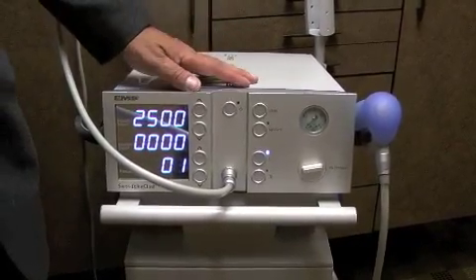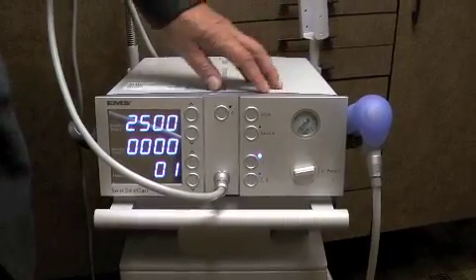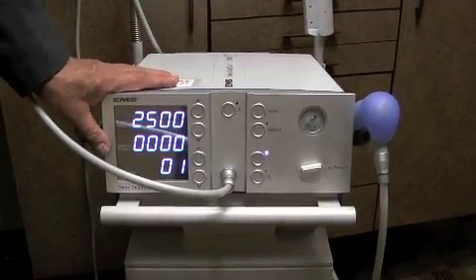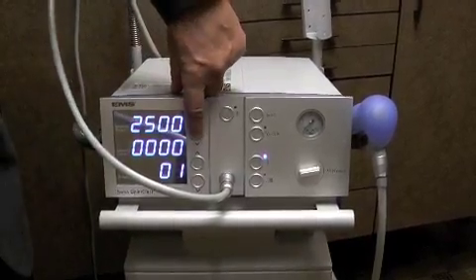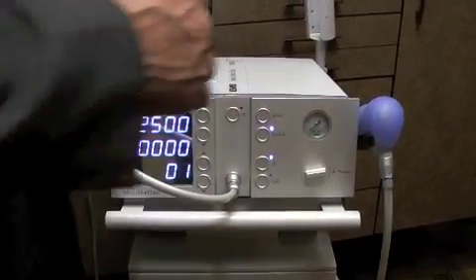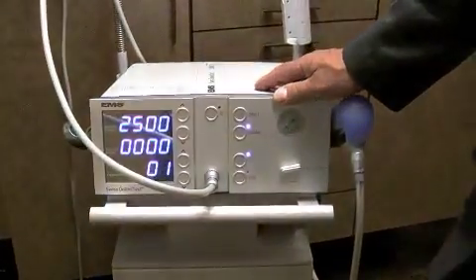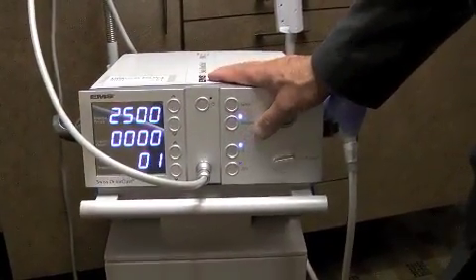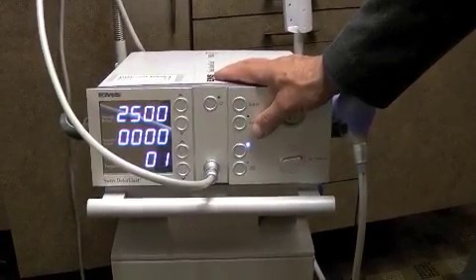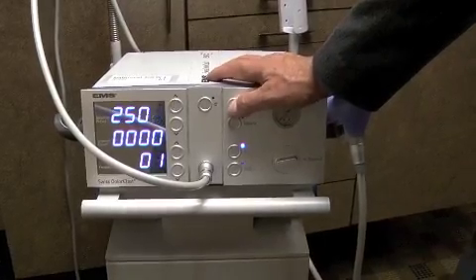2,500, and we can, that's on that one. Next one we'll go to is on impulses. I have to get around to the other side so I can see what I'm doing. Okay, validate that. I'm going to go back to select again, and we're going to keep it on that area.